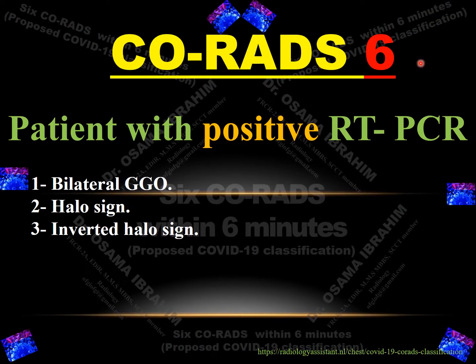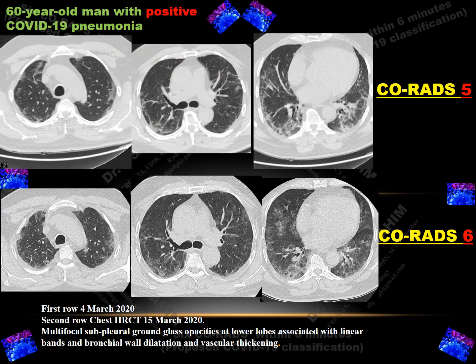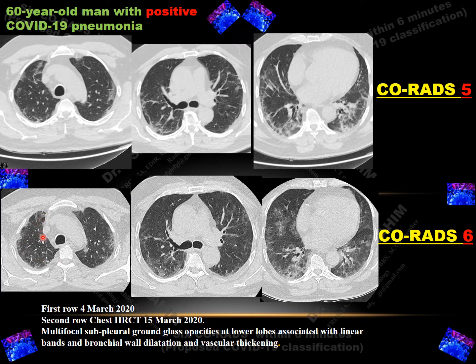Next is CO-RADS 6, which applies to patients confirmed with COVID-19 who are undergoing follow-up scans. A patient admitted on 4 March 2020 with multifocal ground glass opacity, subpleural and basal consolidations, subpleural lines, spider web sign, and vascular thickening — these are typical features, so CO-RADS 5 was classified initially. After the patient tested positive for COVID-19, a follow-up study on 15 March showed ground glass opacity and consolidation, which was then classified as CO-RADS 6 because the positive diagnosis was already confirmed.